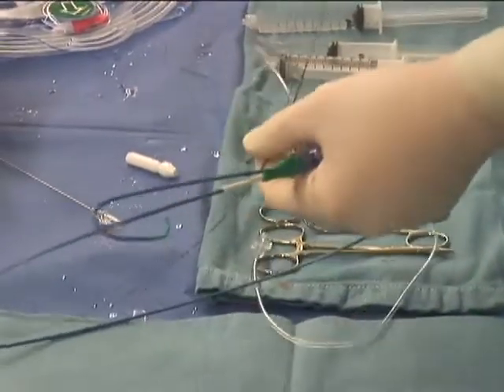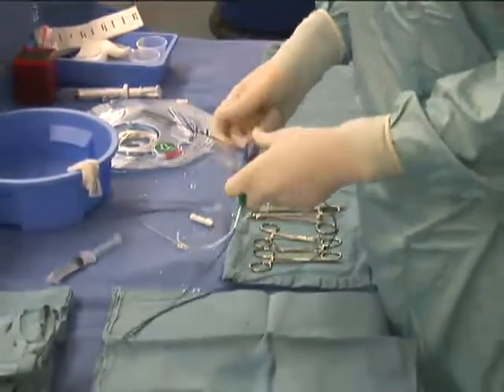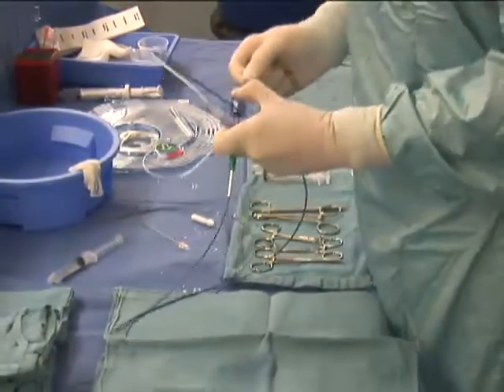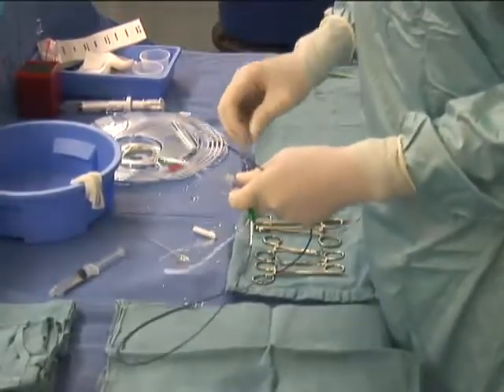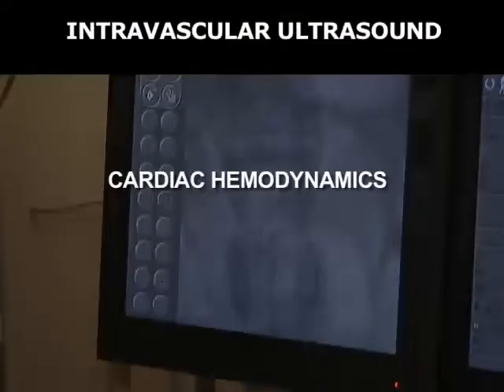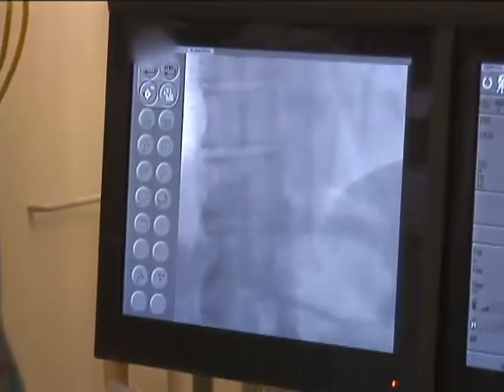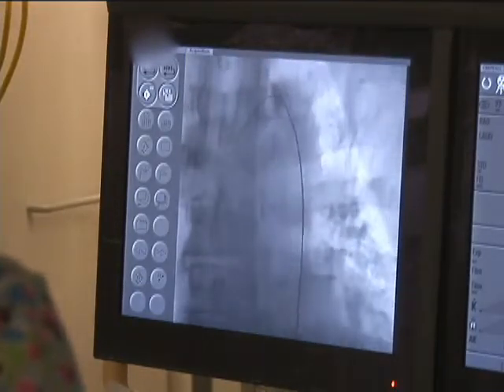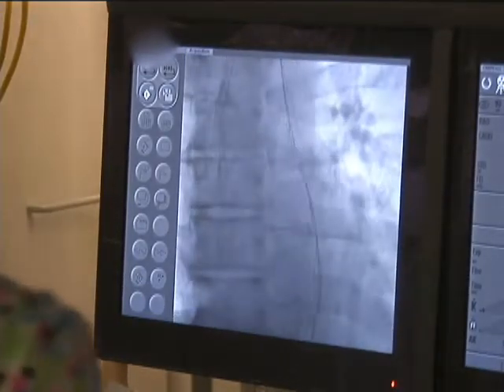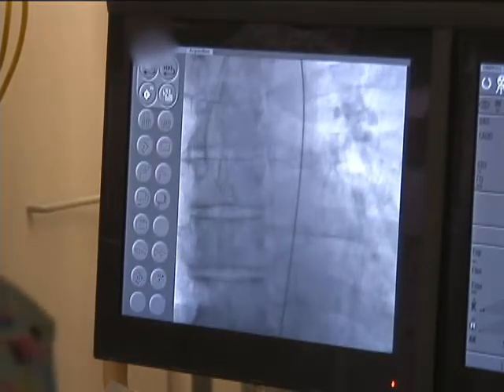The hemostatic adapter is attached to the proximal end of the guide catheter and is then connected to the hemodynamic monitoring system via either the power injector, used in this example, or a standard manifold hand injector. The coronary catheter is advanced over a guide wire to the aortic root, where the guide wire is removed and the catheter is attached to the hemodynamic and injection tubing. The catheter and injection tubing are aspirated, flushed, and zeroed.